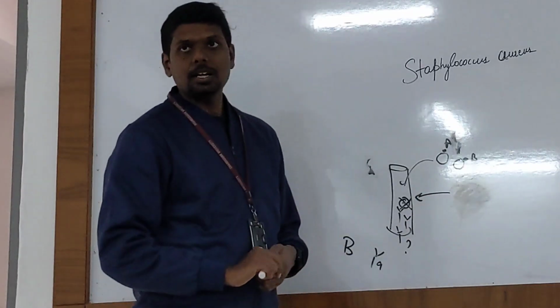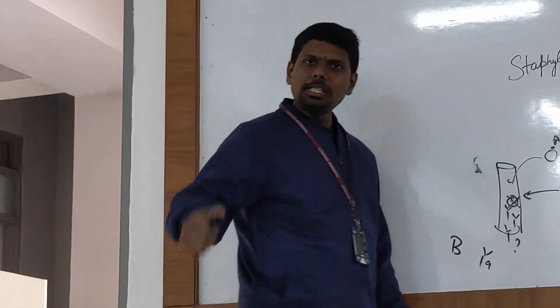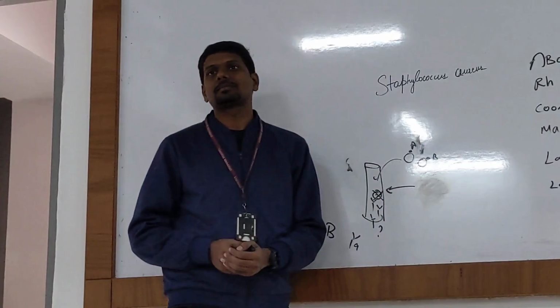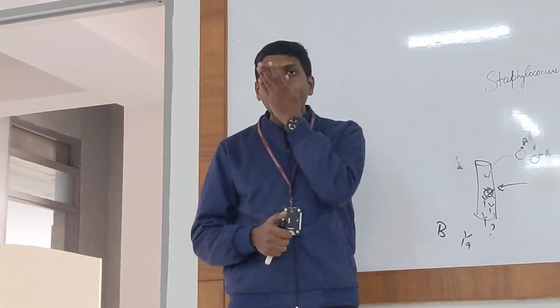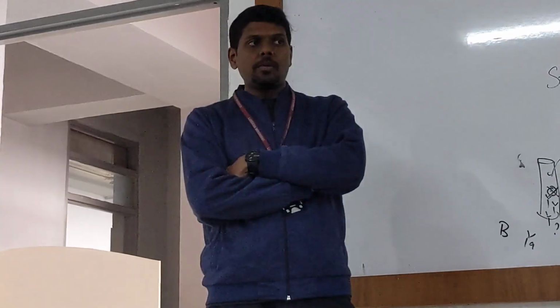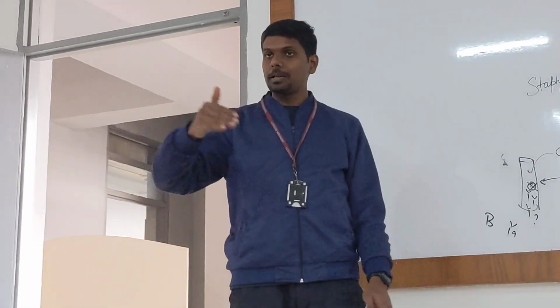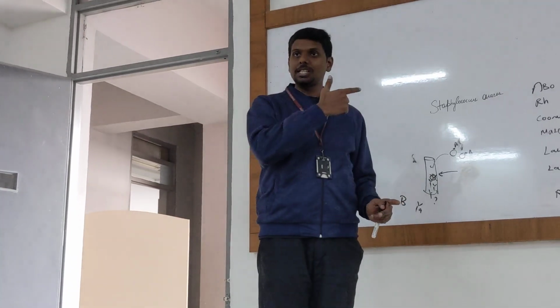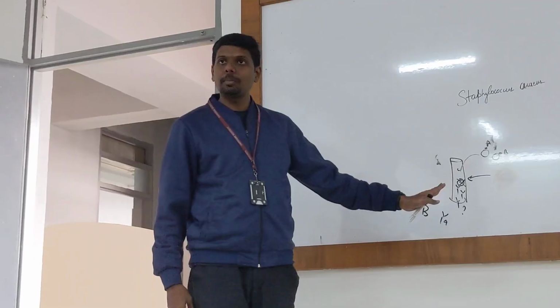Correct. Alright. So this is called reverse grouping. What are your thoughts on reverse grouping? Is reverse grouping necessary? Yes, sir, because it is necessary to detect antibodies. Yeah, sometimes we need to screen the antibodies in the patient, not only antigens, because those plasma antibodies might attack donor cells. So we need to cross-check the antibodies also. So reverse grouping is also mandatory.